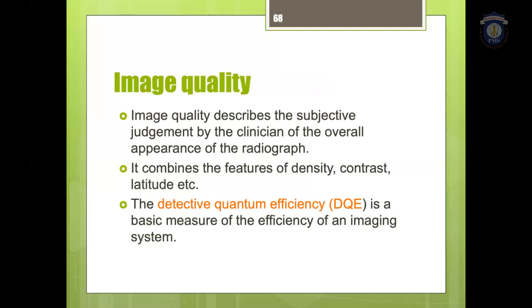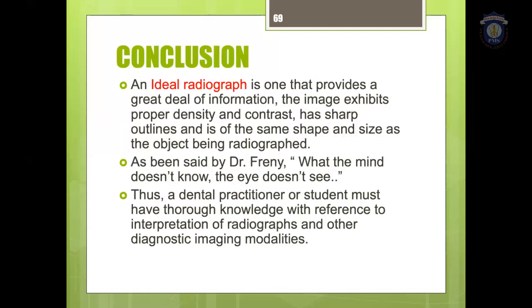Image quality. Image quality describes a subjective judgment by the clinician of the overall appearance of the radiograph. It combines the features of all the ideal characteristics: density, contrast, latitude, etc. The detective quantum efficiency, or DQE, is a basic measure of the efficiency of an imaging system.